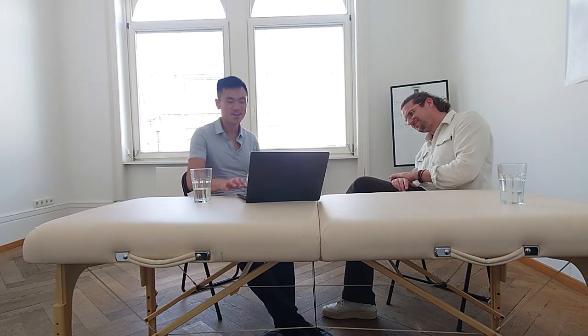So my recommendation, start definitely always in this case with the gluteus medius, then take a look at the foot, and then maybe go on to the quadriceps. But this is something you will experience over time and then make your own picture. But the stabilizer always first. Always first. Okay, thank you.